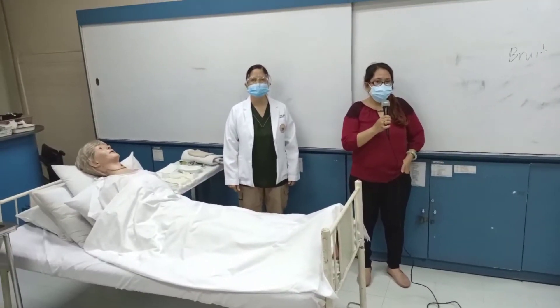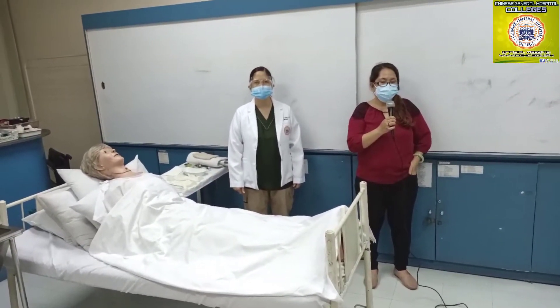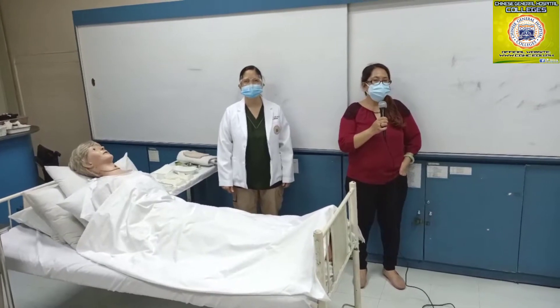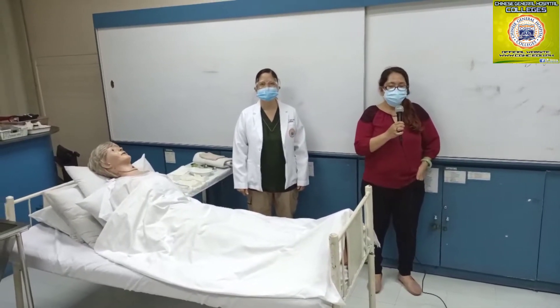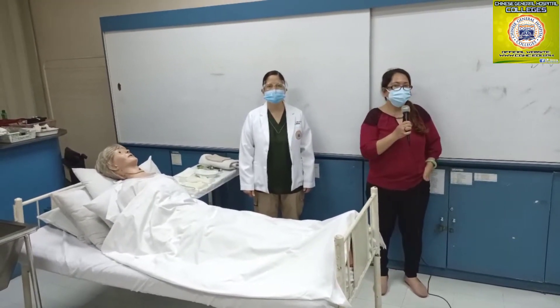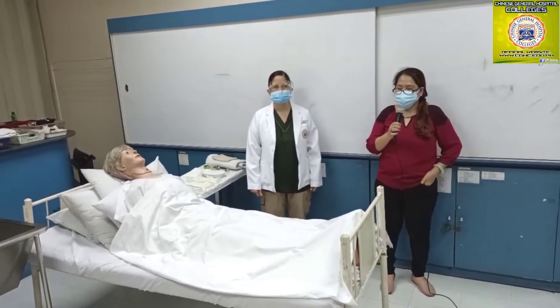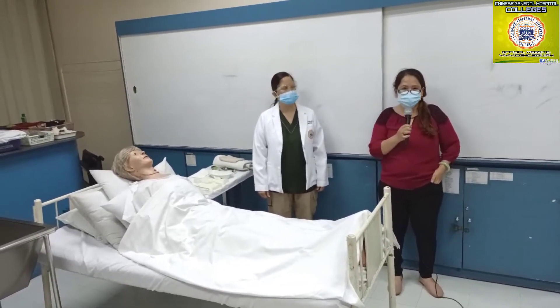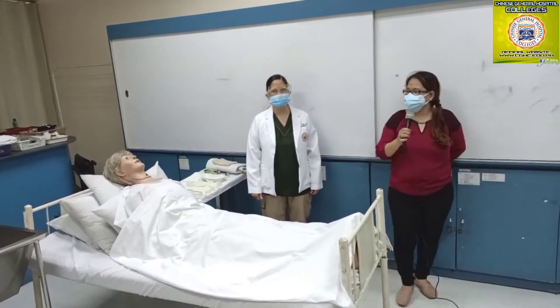A blessed day everyone. Today we are going to be performing NGT insertion and removal. I am going to show how to insert a nasogastric tube.